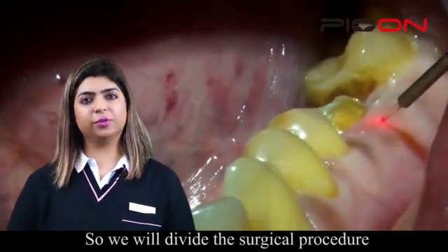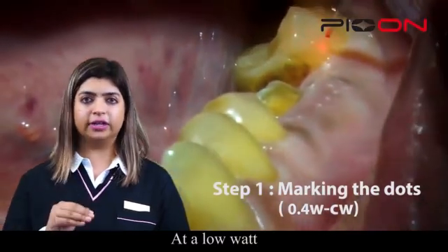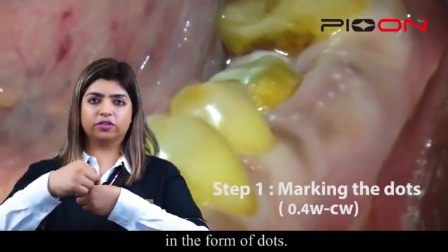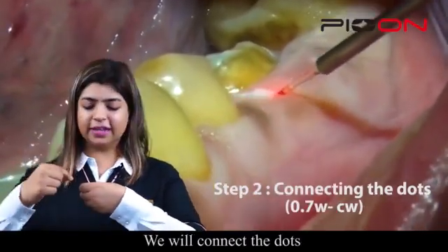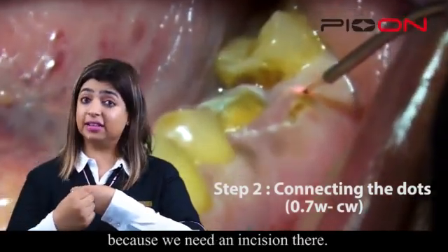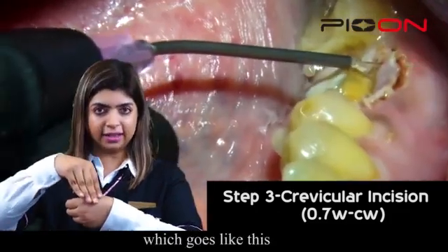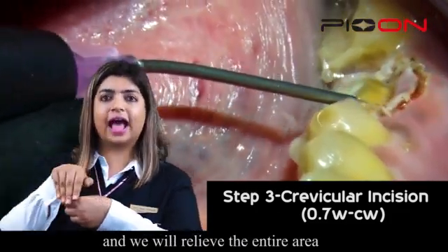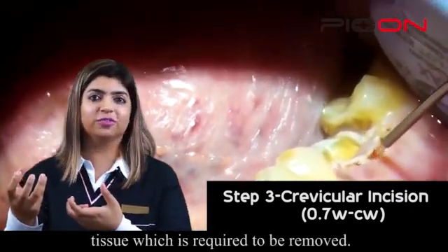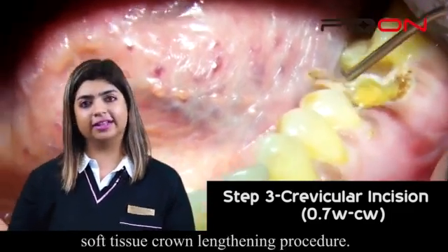We will divide the surgical procedure into three simple steps. Step 1: at a low voltage, we will pre-mark the tissue which has to be removed in the form of dots. Step 2: we will connect those dots and increase the voltage a little bit, because we need an incision there. Step 3: the crevicular incision, which goes like this — we will relieve the entire area, remove the tissue required to be removed, and that's how we will do a soft tissue crown lengthening procedure.